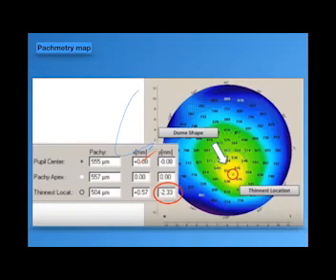The pachymetry map, the three or four points which I have mentioned are so crucial to correlate. And don't forget all the time to do the inter-eye comparison, to correlate both eyes together. So when I send the patient for unilateral LASIK, I always ask for bilateral Pentacam to correlate the inter-eye asymmetry or symmetry. As we said here, correlate the apex of the cornea to the thinnest location and the difference between them.